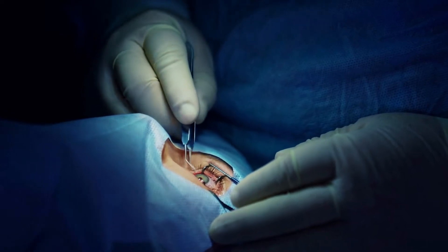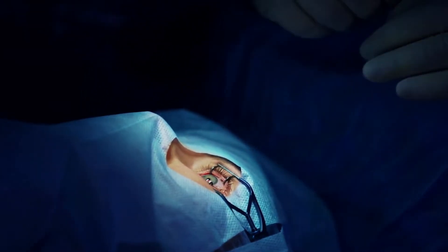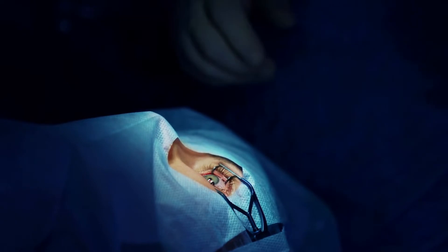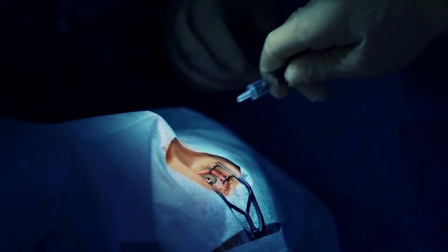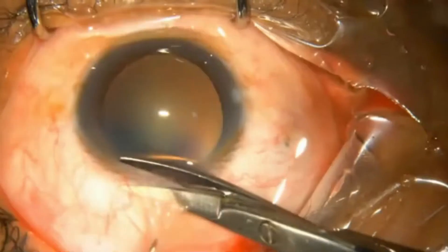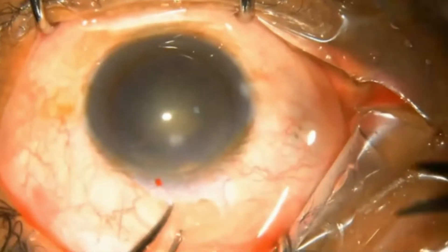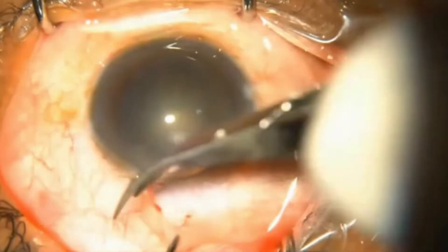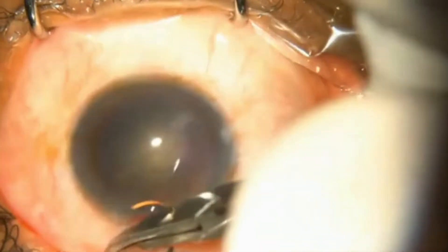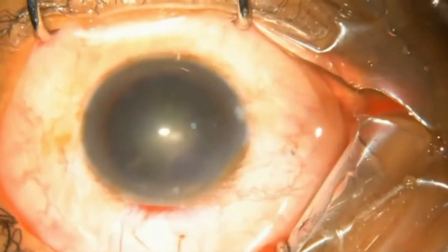Fixation of the globe is a very critical step of any ocular surgical procedure. The globe has to be fixed during various surgical steps like making incisions, intraocular lens implantation, or suturing.